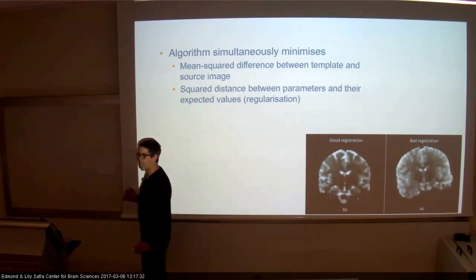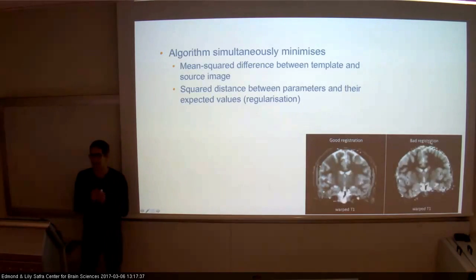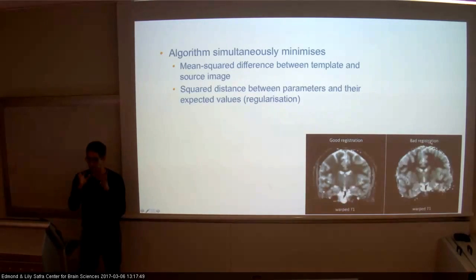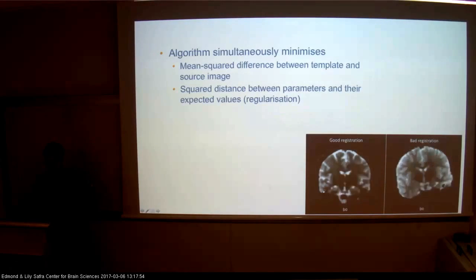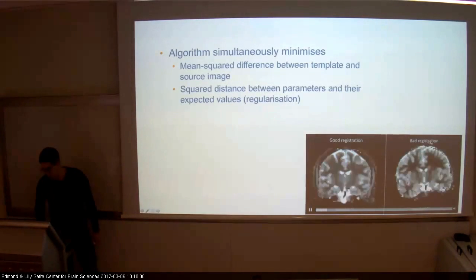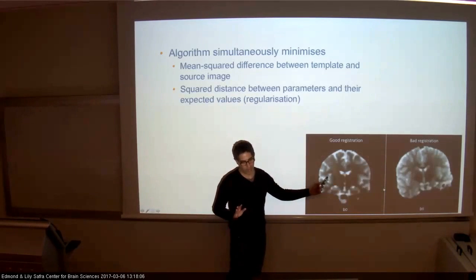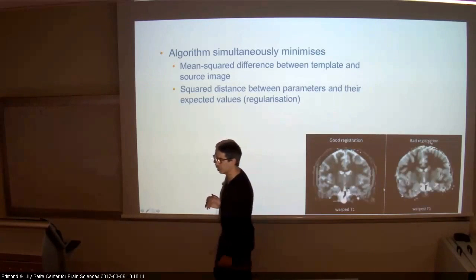That's what the reviewer asked her about: how do you actually make sure that your registration is fine? One image was a measurement which had EPI artifacts, because we measure k-space very fast, and the other one was slower. So there are different artifacts, and she had to use warping to get one image to the other. The reviewer was asking, are you sure they're in the same space? Here there are 2 images, and by eye they might look the same to you, but you can actually calculate it. Here you can see there is some motion. The registration wasn't really successful.